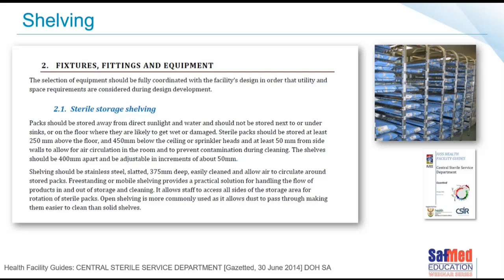As per the guidelines, it also makes good sense to use adjustable shelves or shelving. Freestanding or mobile shelving can also be used. Open slotted shelving is more commonly used. Open slotted shelving allows for the dust to pass through, making it a lot easier to clean than solid shelving that will gather dust.